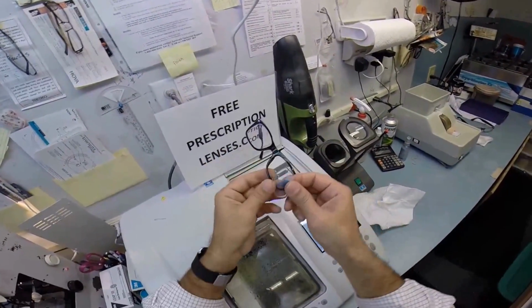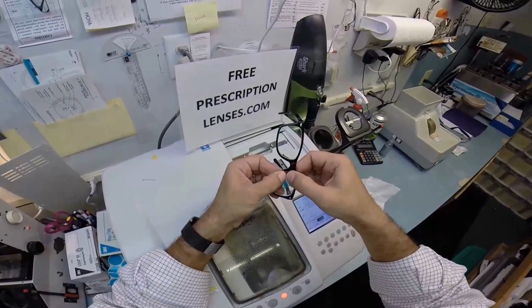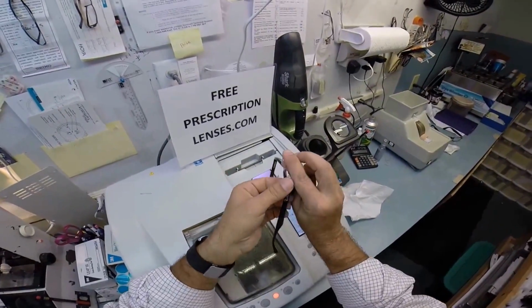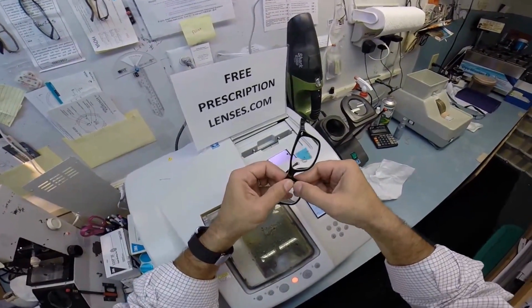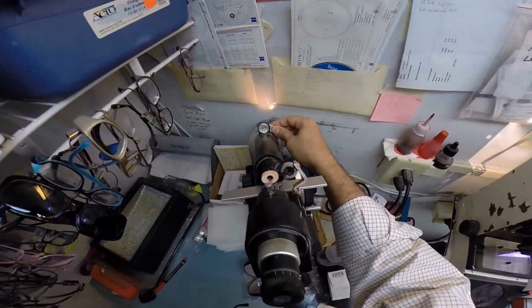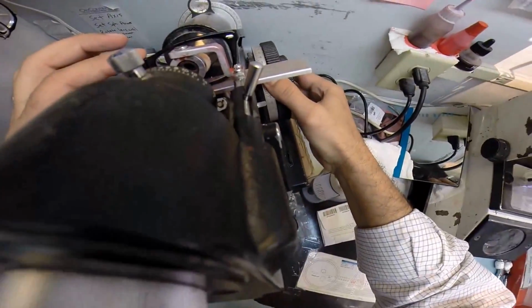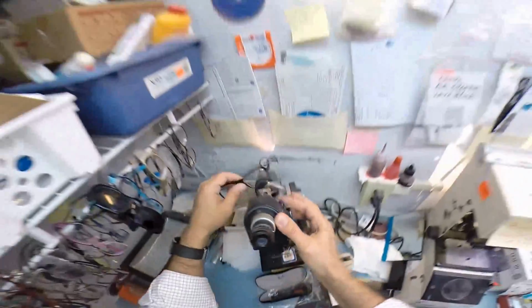In order to pop it in, I turn the frame upright, tuck it in at the outside corner, and press down with the thumbs. Same thing for the right lens. Put your thumb on top of the other thumb, and press down. Let me tuck this one back in and peel the sticker off. I want to spin the axis wheel back to the 84th meridian and put it in, and I am getting -3 again, and then one step of correction, so we end up at -3 1/4.